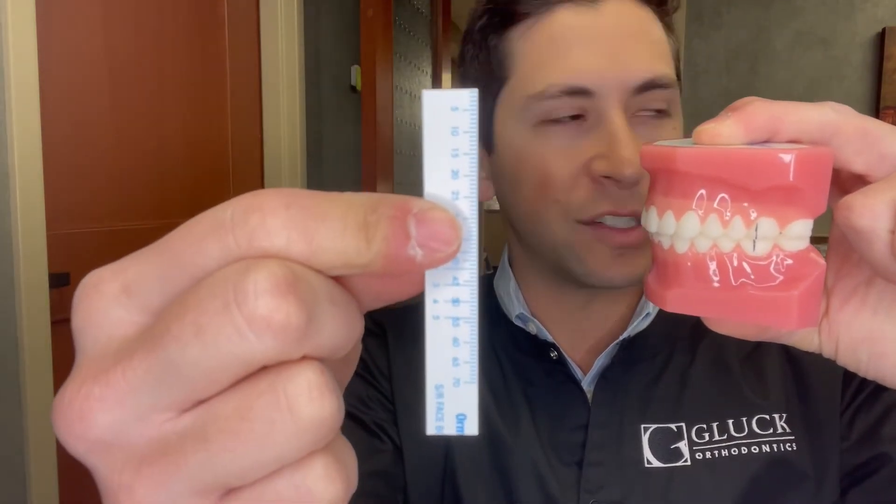Overjet relates to how far the top front teeth are out horizontally, overlapping the bottom teeth. For overjet we use a millimeter measurement. You can use a small millimeter ruler, a perio probe, or if you do this enough, the eyeball method. We look at the incisal edge of the top front tooth and measure the horizontal distance from that incisal edge to the labial surface of the lower anterior tooth.